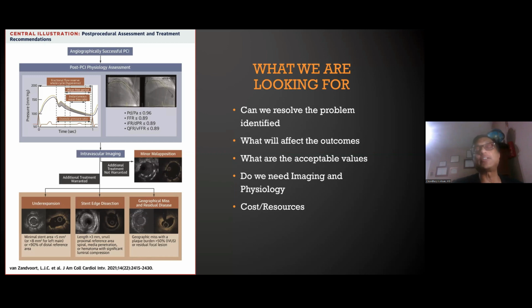We therefore need to assess the physiology and whether there is any residual stenosis that can still affect the flow, and we can assess by fractional flow reserve or iFR or QFR, or we just go with the imaging and make sure that stent is expanded, stent sizing is good, and there is no edge dissections.